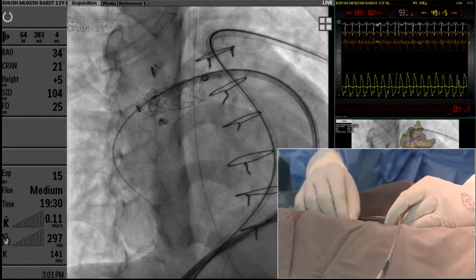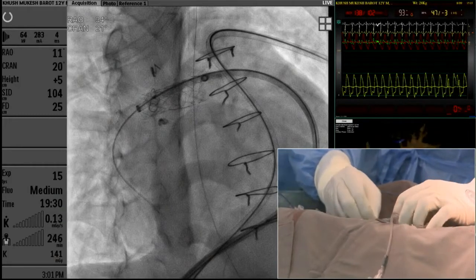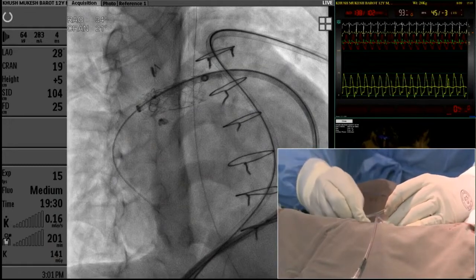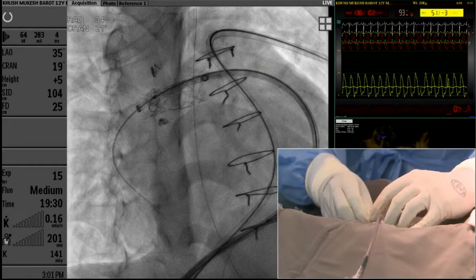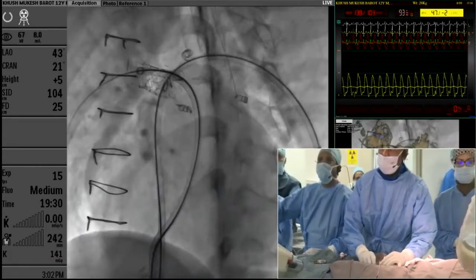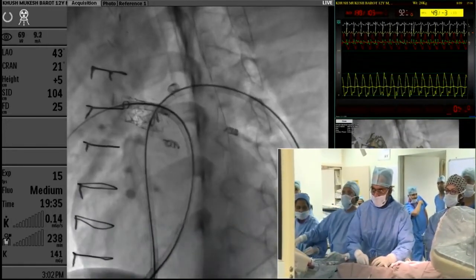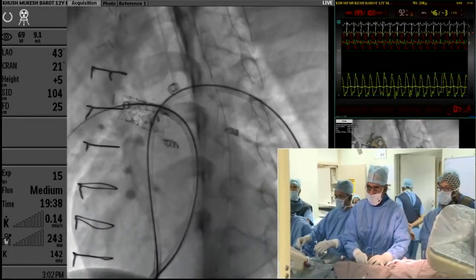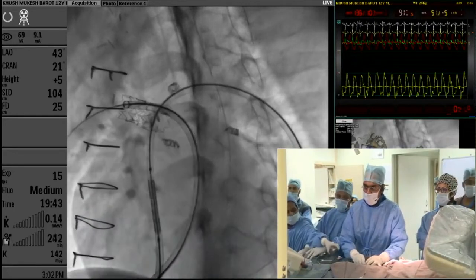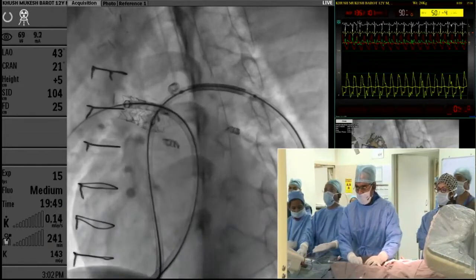Yeah, go to the LPA view, Maruti. Actually, Maruti and Bhushan have been doing phenomenal work on this CT fusion. According to what Maruti says, this is the first time right-sided heart structures are being fused. The Heart Navigator is actually a program made for the aortic valve, TAVR, but they have tweaked it with what is called the Heart Navigator 2 version of the Philips. And now they have got the first demonstration today.